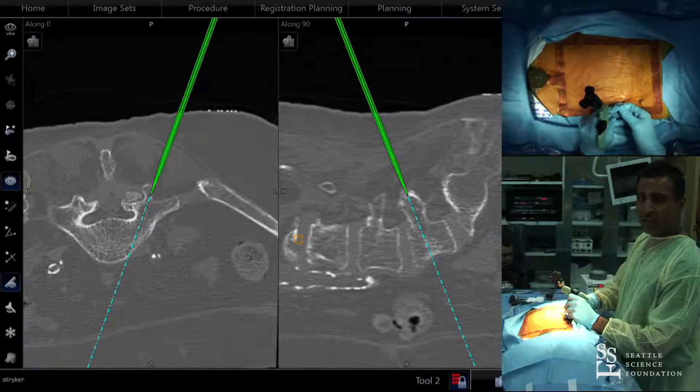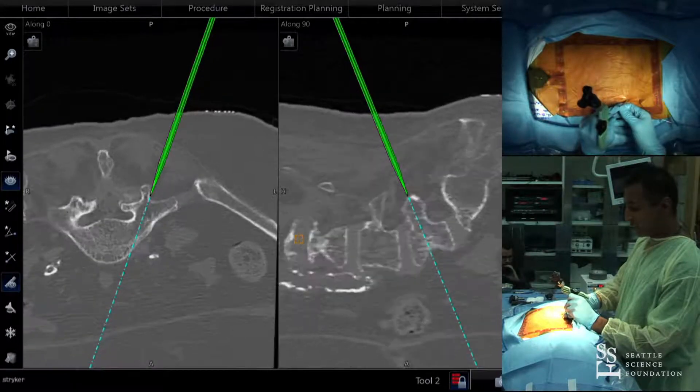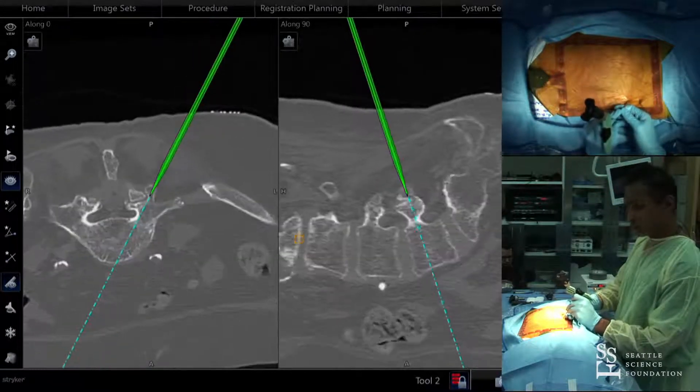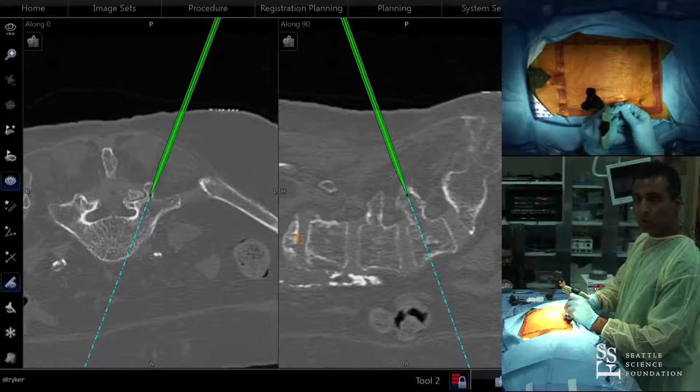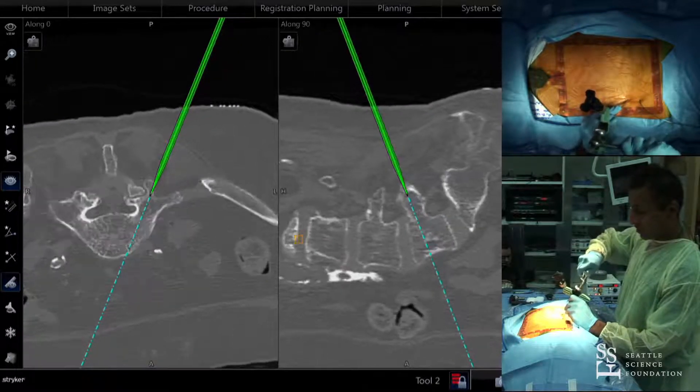Now at L5, we can see a somewhat enlarged facet. I can probably come a little more lateral here to get a better starting point, and then we'll go ahead and start to tap down.